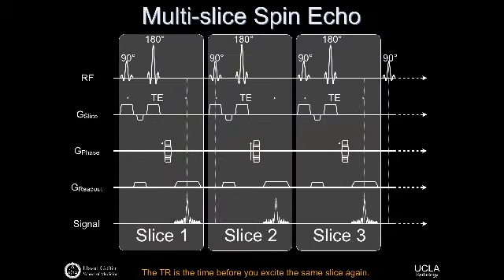It's so-called multi-slice spin echo imaging. In this case, you play a 90 and a 180. Remember, this 90 and this 180 can be used just to excite the slice. So 90, 180, acquire an echo. We've gotten the echo information from that particular slice, maybe a superior axial slice through my head. Now I have to wait at that slice's location for my TR. I need time to elapse so I can get, for example, T2 weighted imaging.